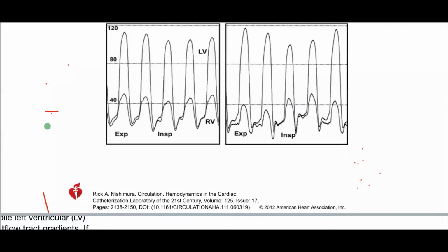This is one side of the story. The other side of the story is that when I have constriction, the heart is limited in expanding laterally. So it depends on the septum. The septum will go left and right so much, the septal bounce.